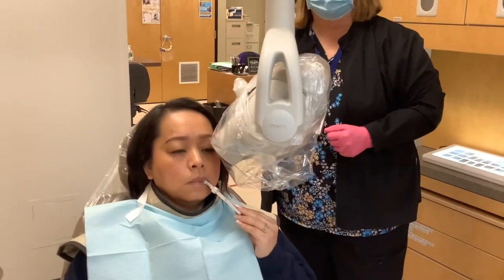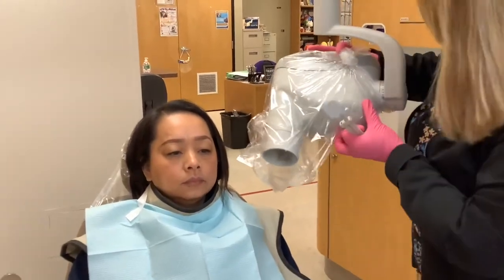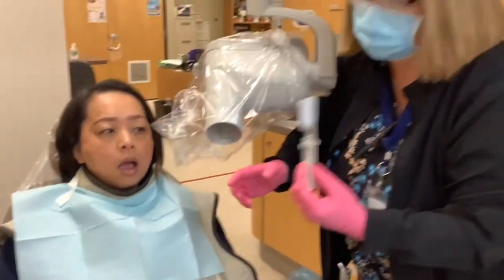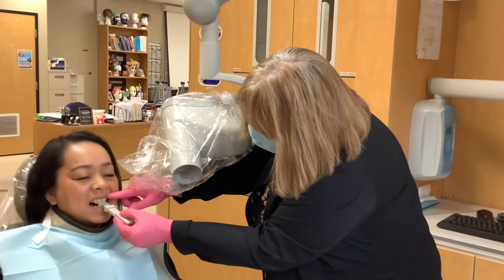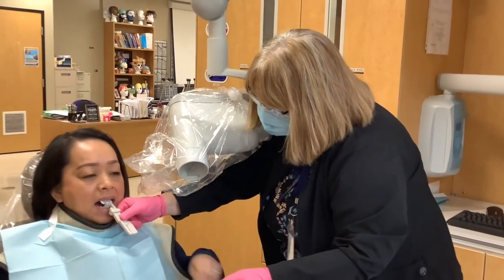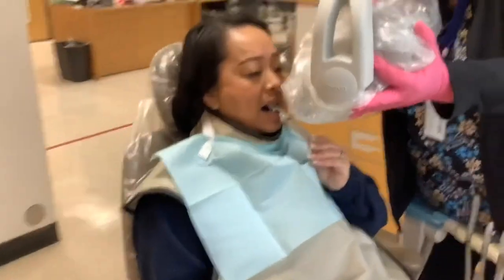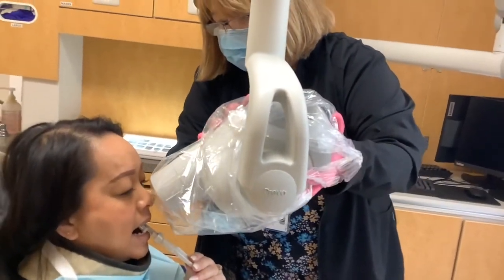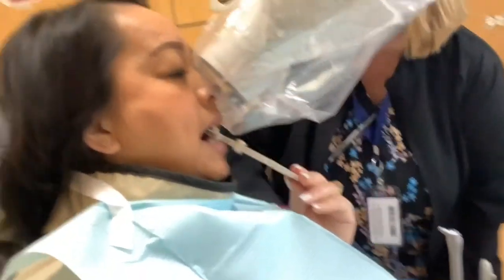I'm dropping back to 40. Going right up front — film in the same position, using a different film but same location on the holder. Getting teeth number 8 and 9 — you should know 8 and 9. Coming up right in between 8 and 9, aiming for that contact line. Raise it up right over the nose. I need to get the end of that film — my angulation is there, my film is there, it should all be in one shot.